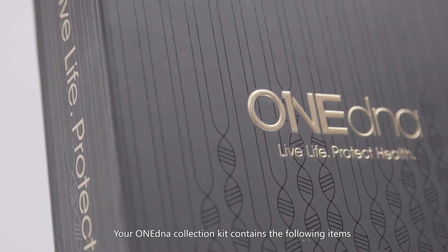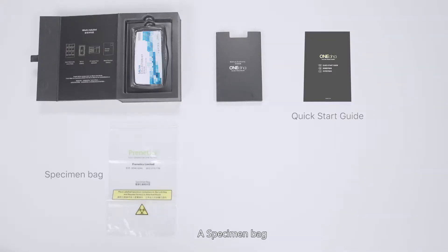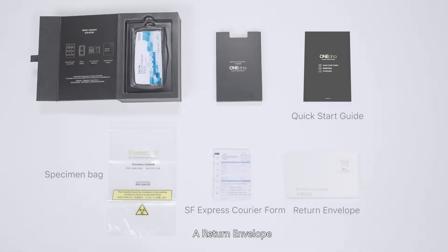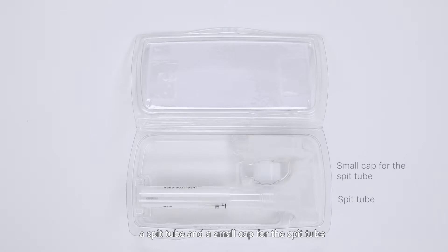Your OneDNA Collection Kit contains the following items: a Quick Start Guide, a Specimen Bag, an SF Express Courier Form, a Return Envelope, and a Saliva Collection Kit, which includes a spit tube and a small cap for the spit tube.